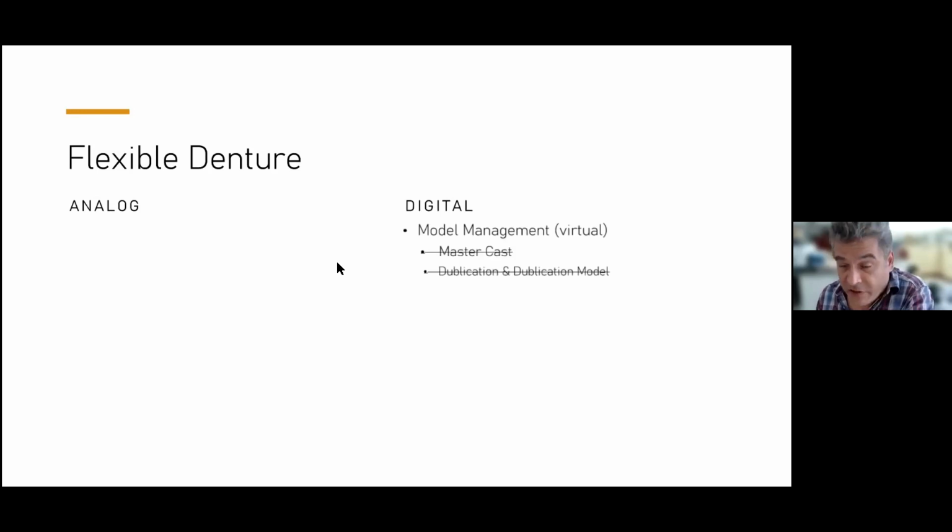In the digital world, if you get, for example, an intraoral scan, like I will show you after, you don't have a model anymore. You have a virtual model. Of course, you can print this if you need to. So you don't have to do the Mastercast. You don't have to do any duplication. So you save materials and time on this one.